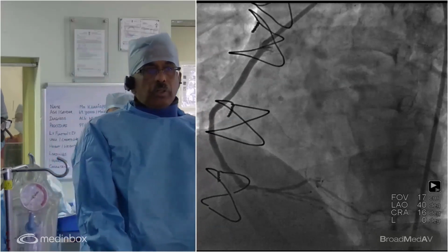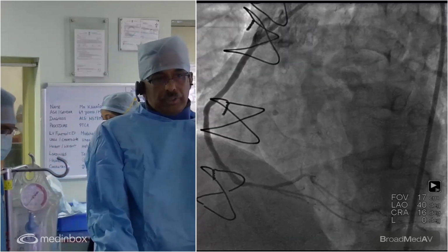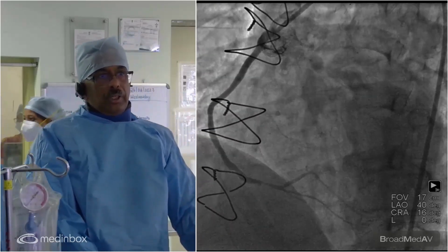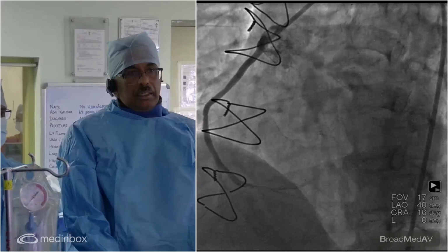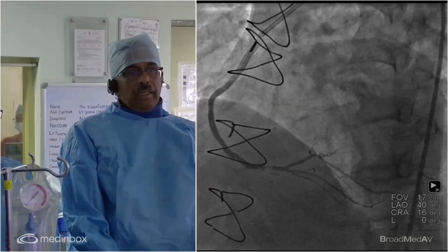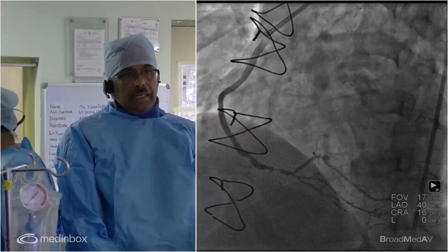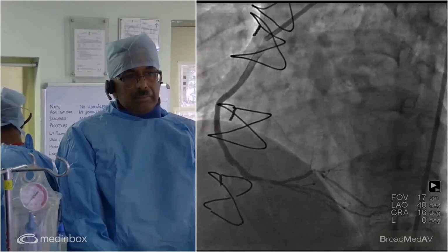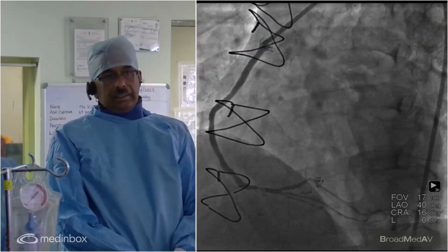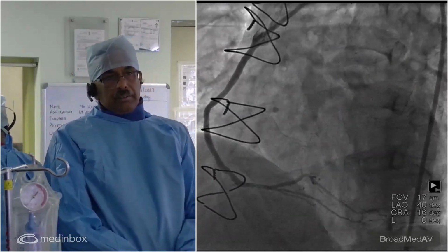Remember, all grafts should be hooked with a multi-purpose catheter and not with other diagnostic or guiding catheters, because you lose support. You can see in this view, which is an LAO 40 cranial 16 view, a lesion which is ulcerated in the distal graft at the anastomosis of the PDA PLV junction. There's also disease proximal to the lesion, and the plan is to do IVUS-guided imaging. We can do OCT, but unfortunately there's no length here for the OCT catheter.